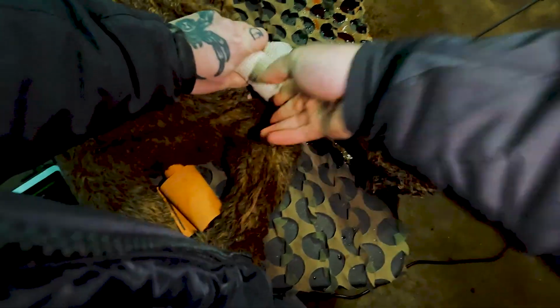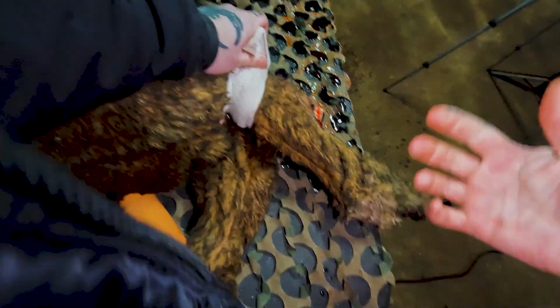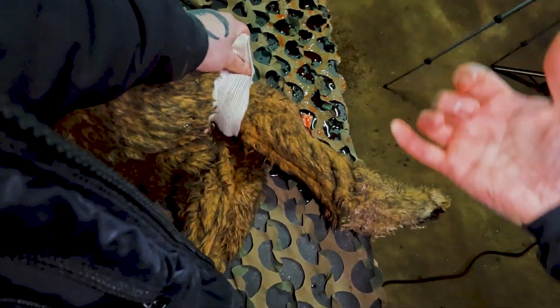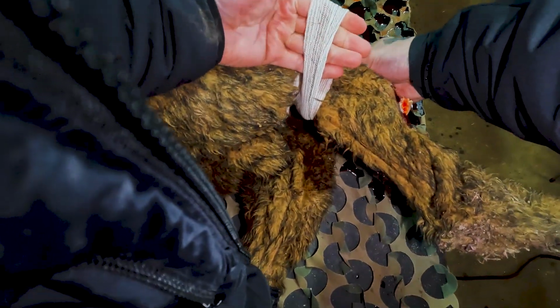So this mannequin is or would still be bleeding if this tourniquet wasn't working. With any kind of tourniquet or bandage to tourniquet effect, if you can fit something underneath it, then it's not working. You don't necessarily have to use the whole roll. You can always place your hand underneath a loop.